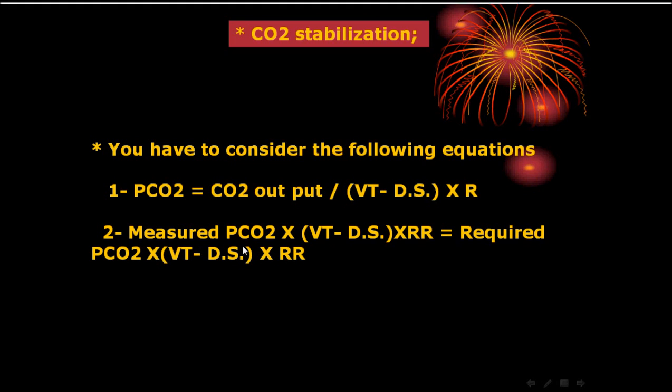If you want to adjust it, we have the measured carbon dioxide after 20 minutes. This is the actual partial pressure of carbon dioxide. This is the tidal volume, all of it. This is the tidal volume on the ventilator, and this is the respiratory rate on the ventilator.